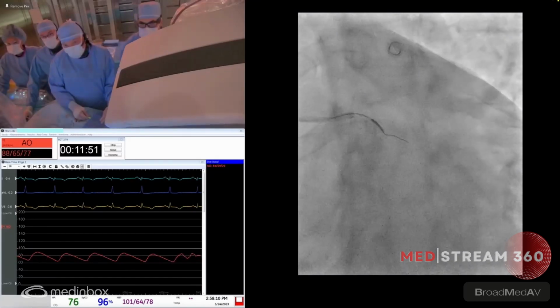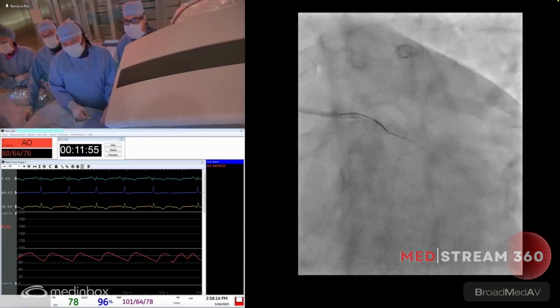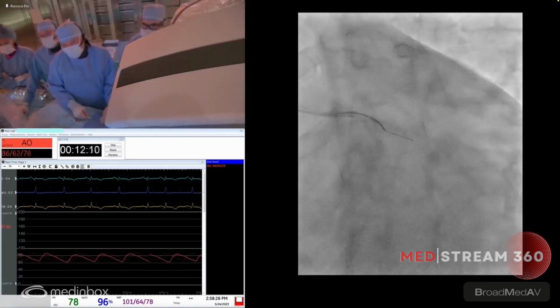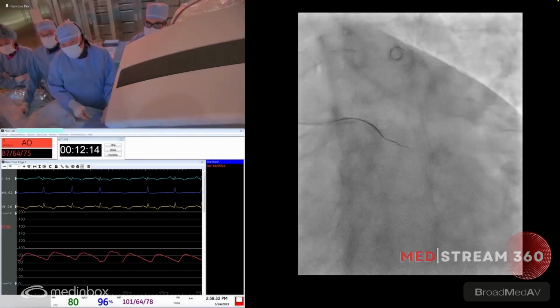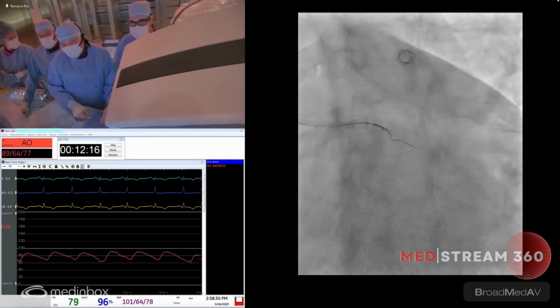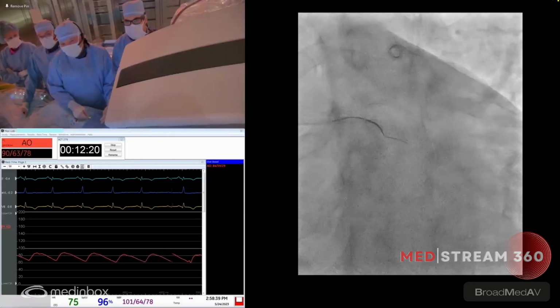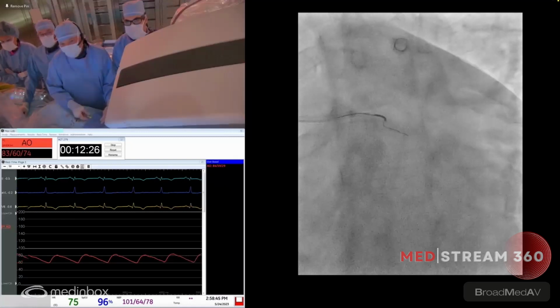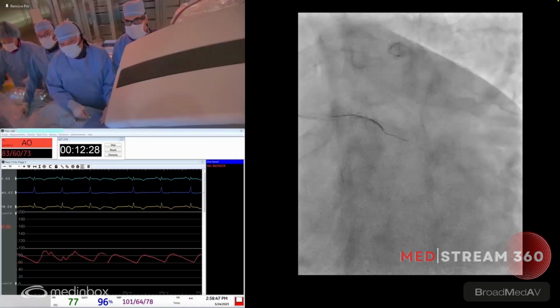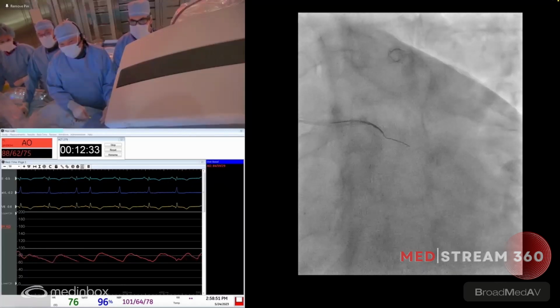We did the first part of this case, by the way. We'll keep working on it for sure. But it shows you the complexity in a young 37-year-old man with a STEMI, but combination of Kawasaki disease probably in the past. Asymptomatic, we don't know. I tried to ask him the question several times. Severe dyslipidemia. And so now we have aneurysm, multiple aneurysms, occlusion, calcium.